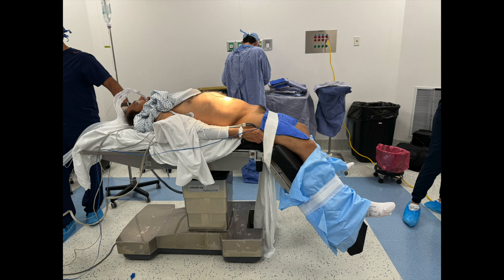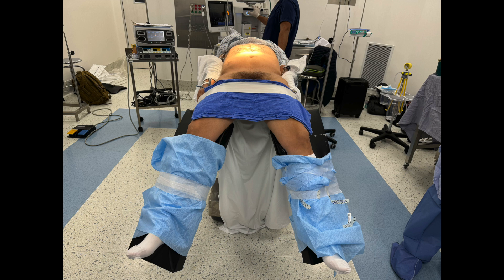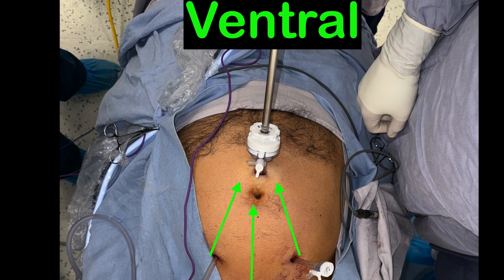This is the way I position the patient. Looking at it from the side, you can see that the legs are bent to the back so they can be out of your hands' way. This is how open I keep the legs, just to stand in between them.